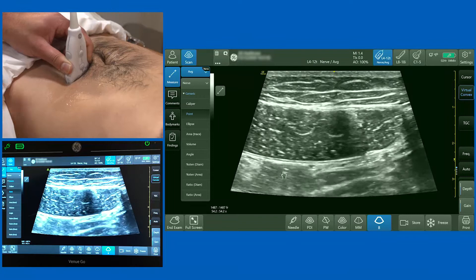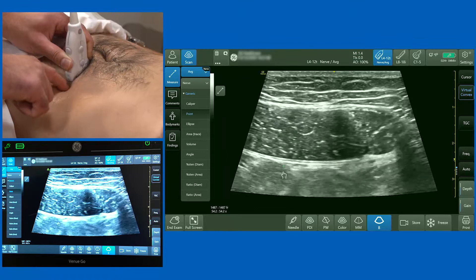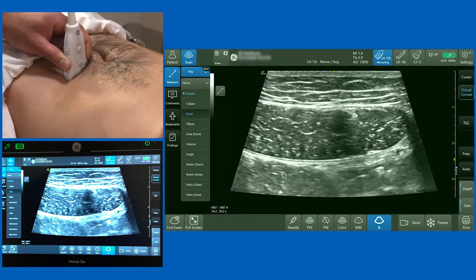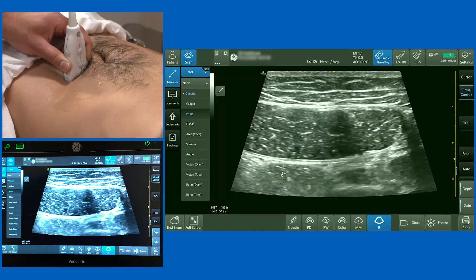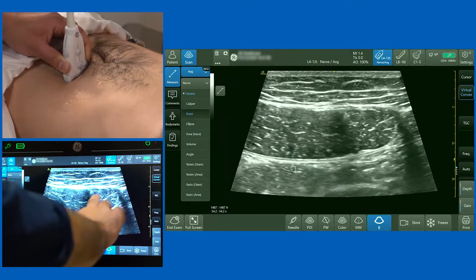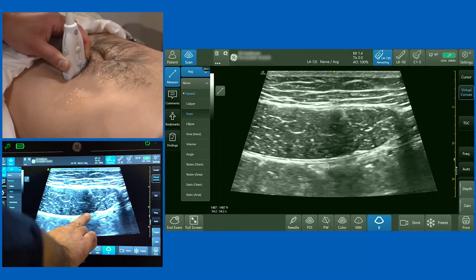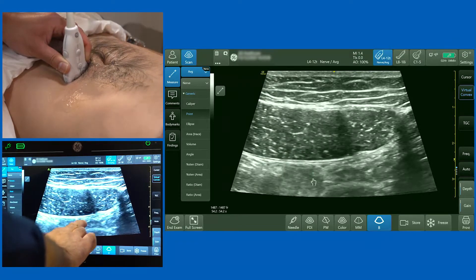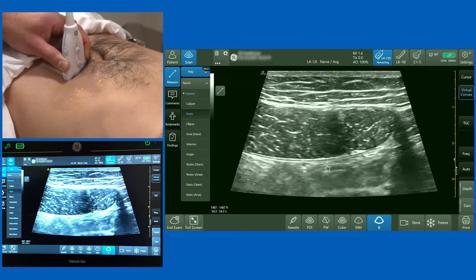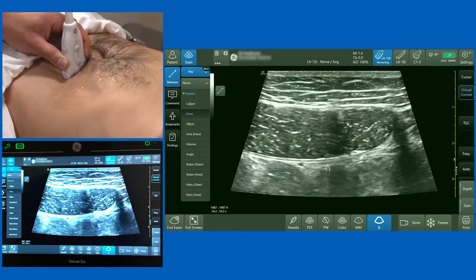Here you bring your needle in from lateral to medial — you can see the skin indentation as I press. Your aim is to inject local anaesthetic between the posterior aspect of the muscle and the posterior rectus sheath. It's often useful to start injecting local anaesthetic slightly before you reach your target depth, to avoid overshooting. When you're in the right place you get a very obvious appearance of local anaesthetic spreading between the muscle and the posterior rectus sheath.